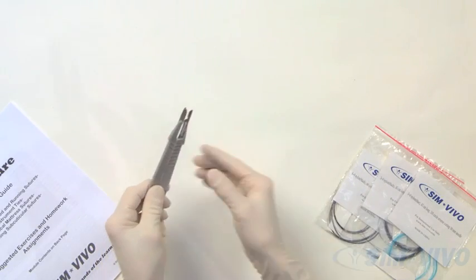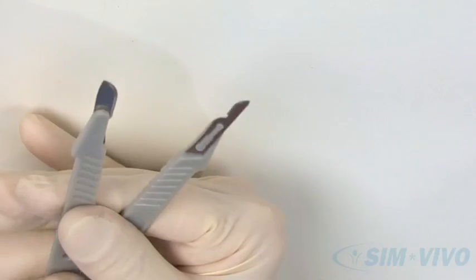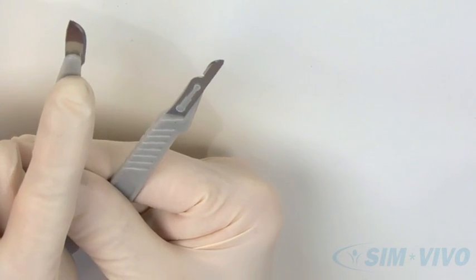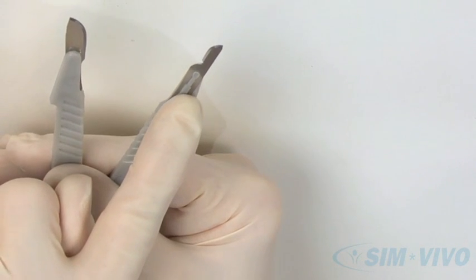These are scalpels for cutting the simulated skin. The larger blade is called a number 10 blade, and the smaller blade is called a number 15 blade.